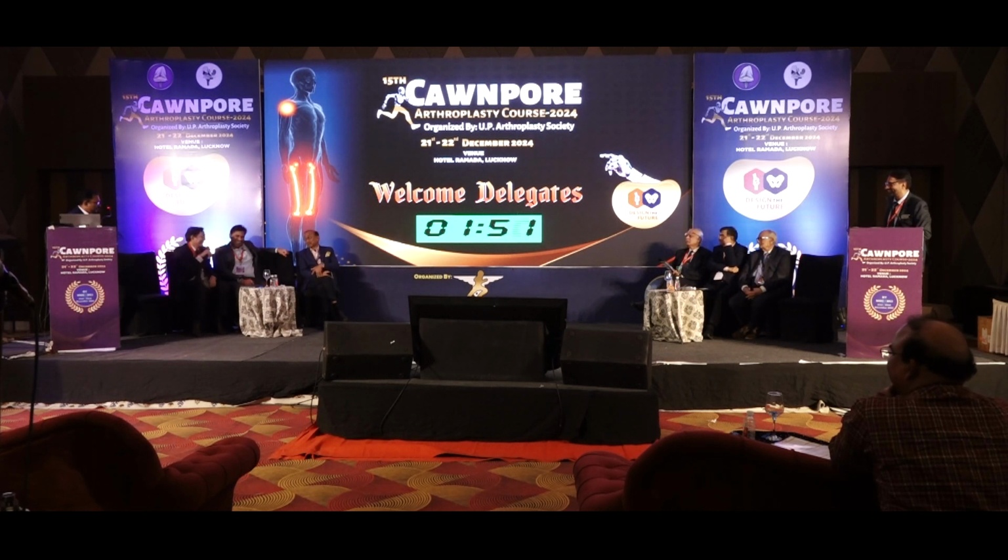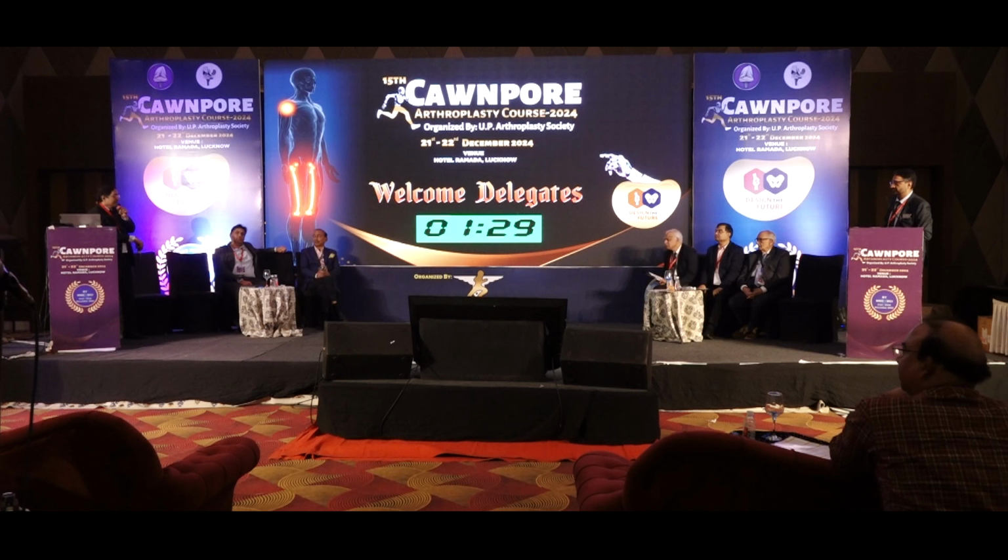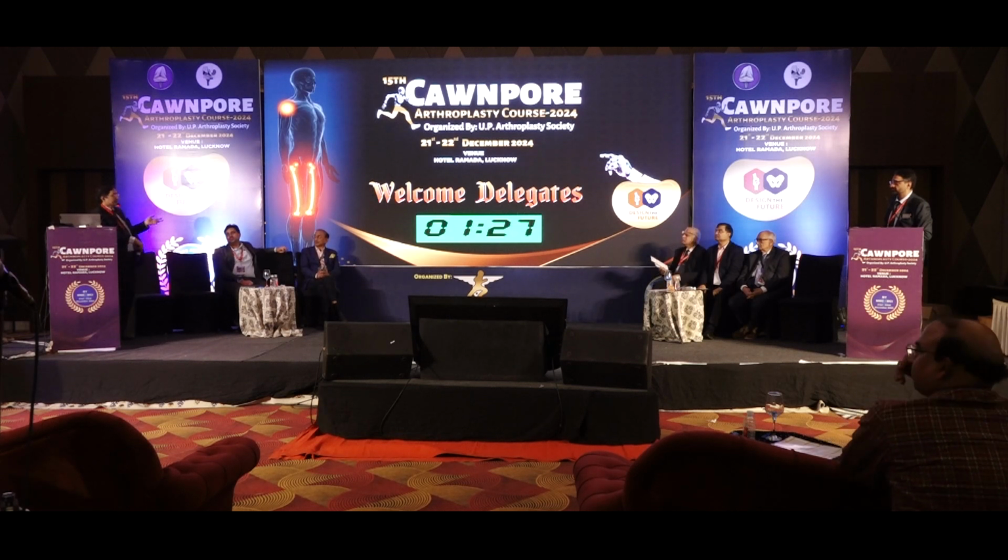I have done demonstrations of CR knees. Yeah, but again, conversion, I think this was brought out by him also, converting a CR knee intraoperatively to PS knee is also not so easy because your flexion gap increases once you cut your PCL. That's again scary. But I think, sir, what you are talking about, the newer CR implants are much better than they were in the early 2000s.